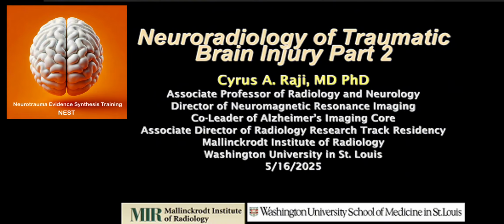Yeah, I think that 1.5T acquisitions are certainly possible because both 1.5T and 3T are considered high field imaging scans. The normative data of the NeuroReader as well as the IMECA include both 1.5 as well as 3T. It is possible to do ASL at 1.5 Tesla as well. In fact, we've done high quality research with that at the University of Pittsburgh as far back as 15 years ago. So it's certainly possible to do.